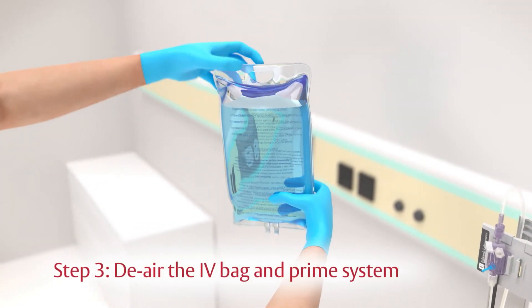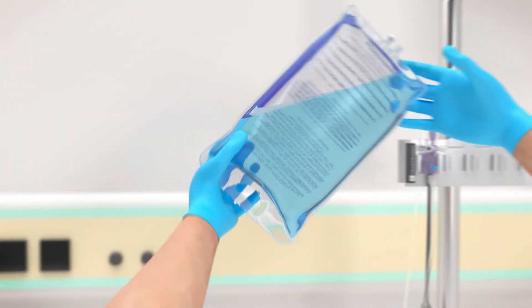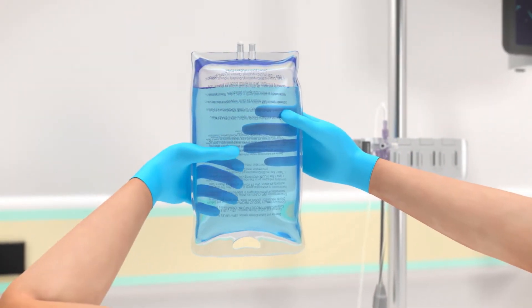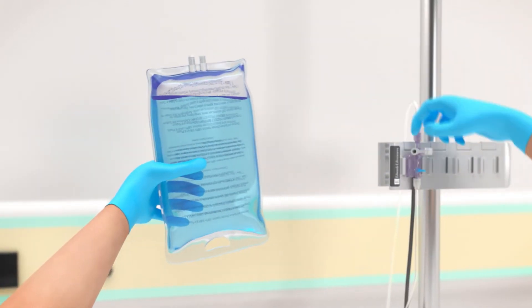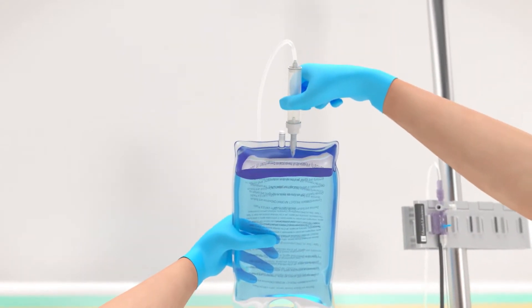Step three: de-air the IV bag and prime the TruWave system. Invert the normal saline IV bag so air rises to the base of the bag. Anticoagulation per institutional policy. Spike the IV bag with the fluid administration set, keeping the drip chamber upright.